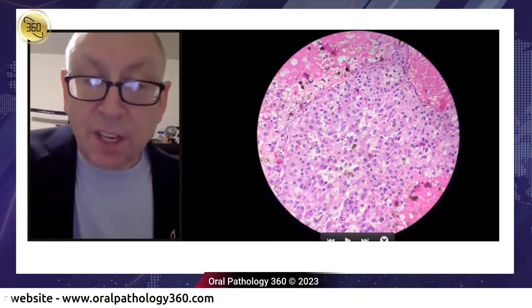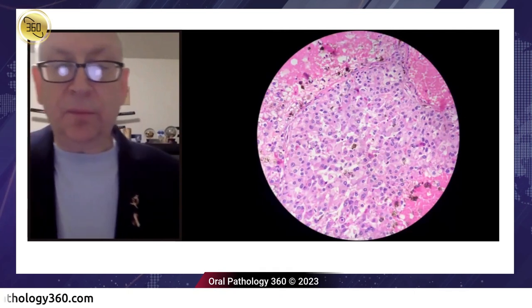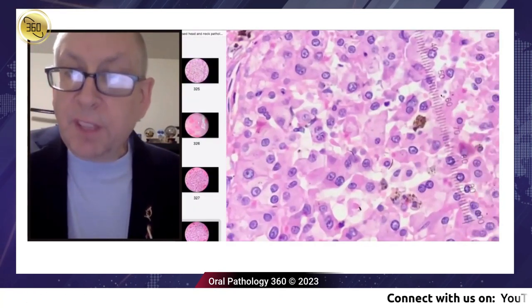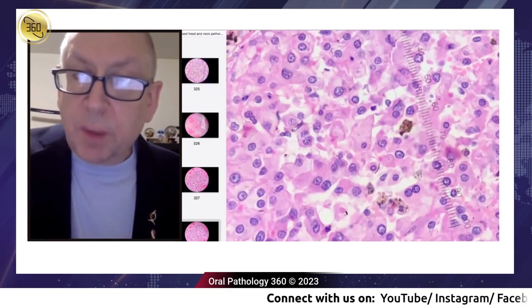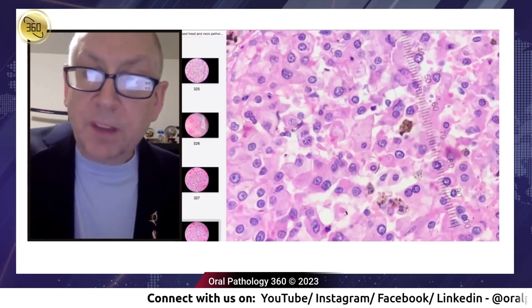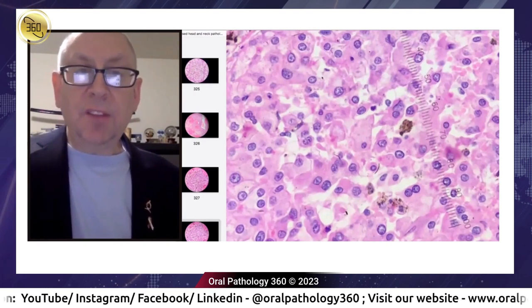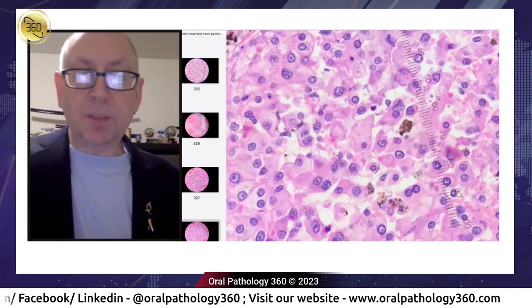And again, if I look at this, let's blow this up again. Let's count the marks. I don't remember what the microns were. But again, you can see that nucleus is probably like three marks big. Normal should be one or two, as I recall. And again, they have this eosinophilic cytoplasm. Some are optically clear.